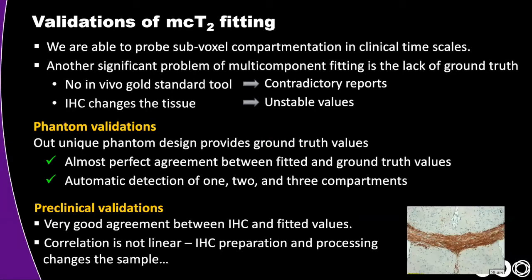Validations were also promising. There is the problem of lack of ground truth, because there is no in vivo gold standard today, so there are contradictory reports, and histology changes the tissue. Our phantom validation, our unique phantom design, provided actual ground truth values. And this perfect agreement between fitted and ground truth values is the thing that I find the most encouraging about this technique. Still, we had nice agreement between histology and fitted values.